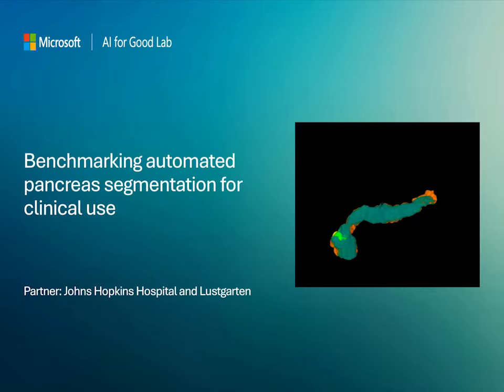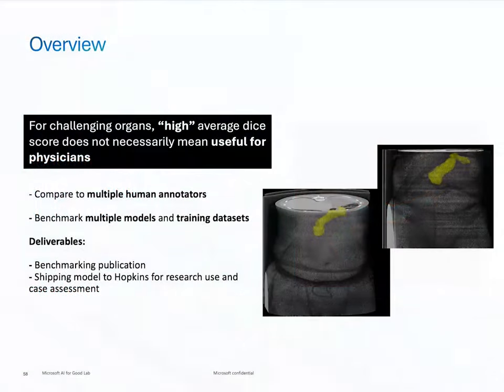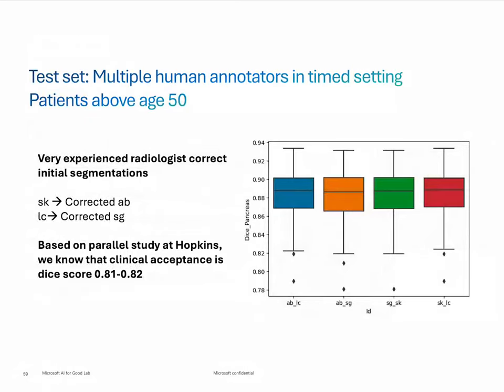So one of the things we worked on with Microsoft is looking at being able to find the gland. And what we did is we trained the computer and we looked at how well the computer did compared to experts. We had 4 experts. Now, one of the things you recognize, even experts will vary. It's hard to be exact.